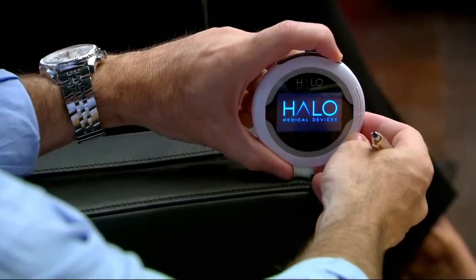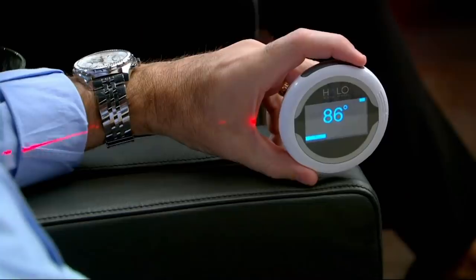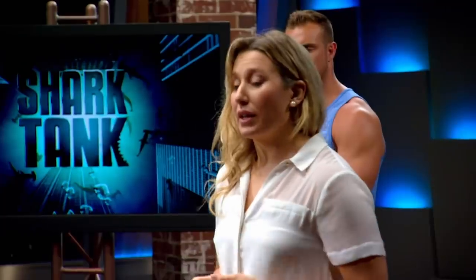Can you give us a lesson on how to use it? Press and hold the right-hand button and you'll see the Halo logo come up. So once the lasers are on, you align the landmarks. It's got lasers. They're a low-class medical laser. It's a little accelerometer that just gives you the displacement from where it was zeroed, effectively. Exactly. Dual chip, magnetometer and accelerometer. That's nice, isn't it? Well, that's really, really quite cute technology.